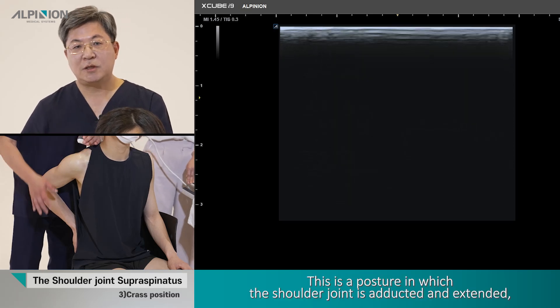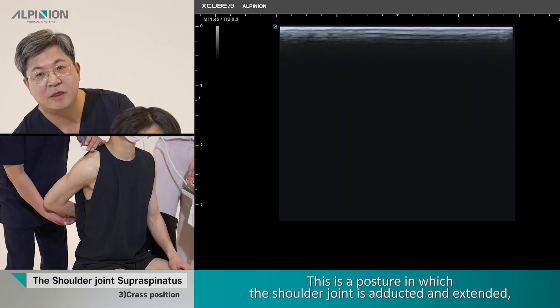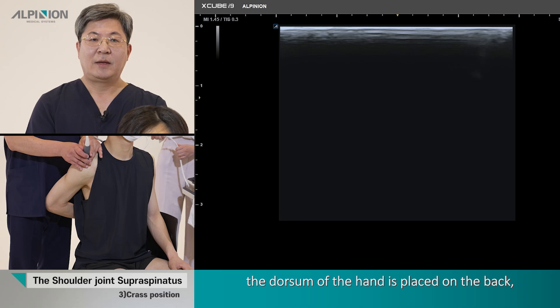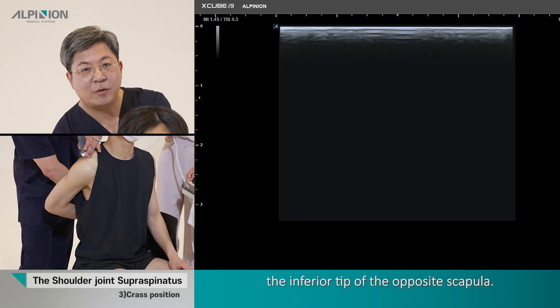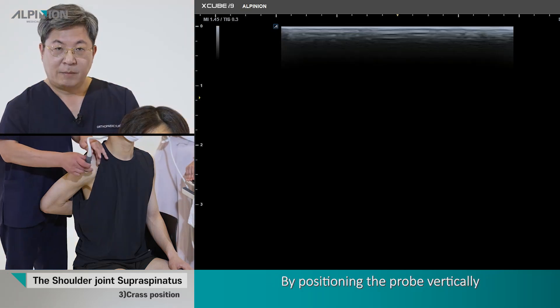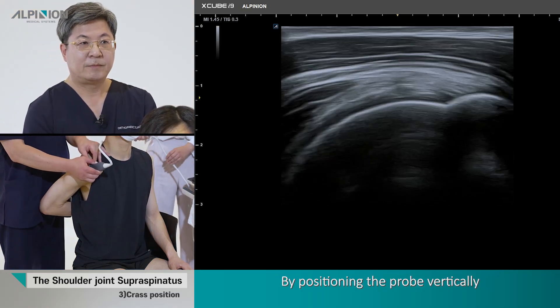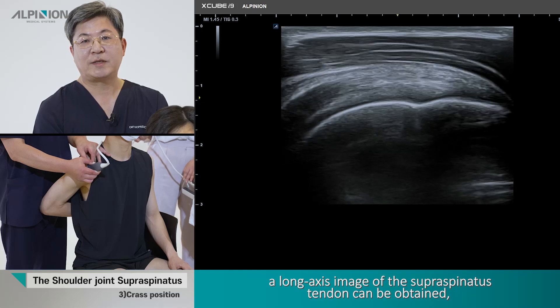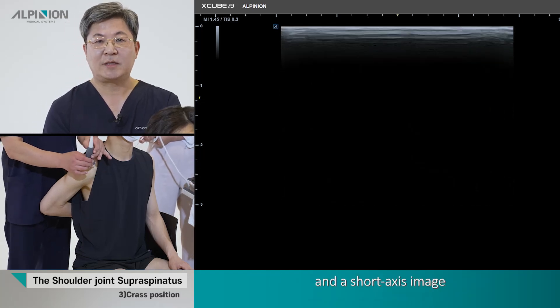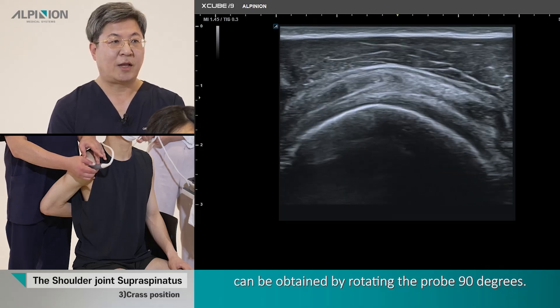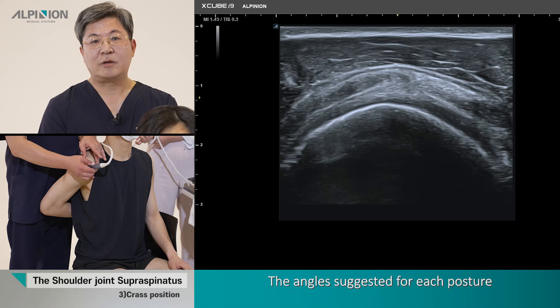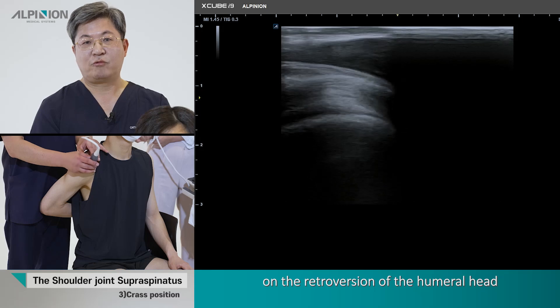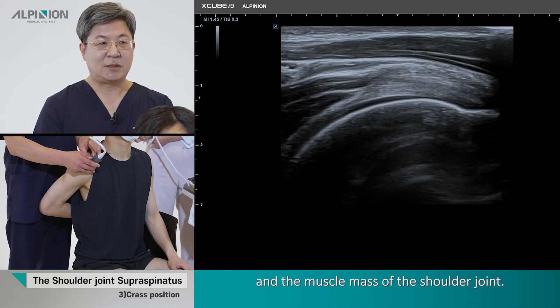In the Crass position, the shoulder joint is adducted and extended. The dorsum of the hand is placed on the back with the fingertips pointed toward the inferior tip of the scapula. By positioning the probe vertically below the acromioclavicular joint, a long axis image of the supraspinous tendon can be obtained, and the short axis image can be obtained by rotating the probe 90 degrees. The angles suggested for this posture may vary depending on the relative version of the humeral head and the muscle mass of the shoulder joint.